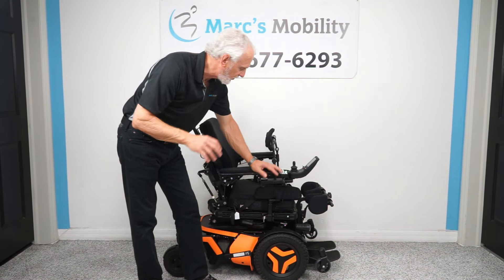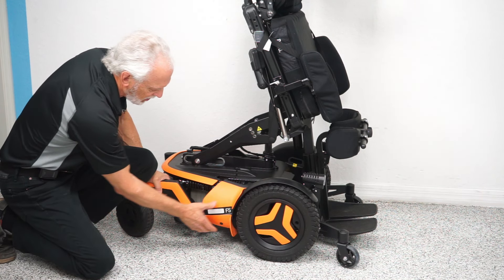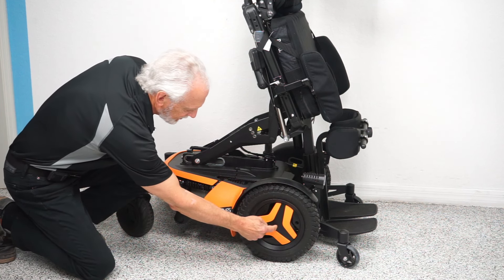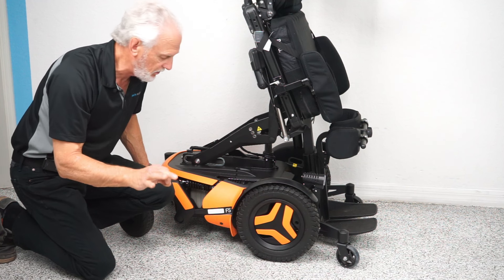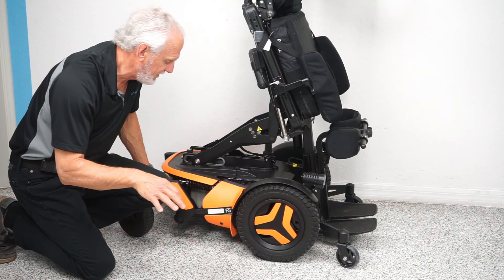There's an anchor point right here to secure your chair, and another one behind the fender. There are four of these around the chair for transport. There's a motor right here behind this plastic cover — you can see the end of the motor. This motor goes directly to the hub: no chain, no belt. It's a direct drive to the hub, so it's a lot quieter and a lot easier to maintain.